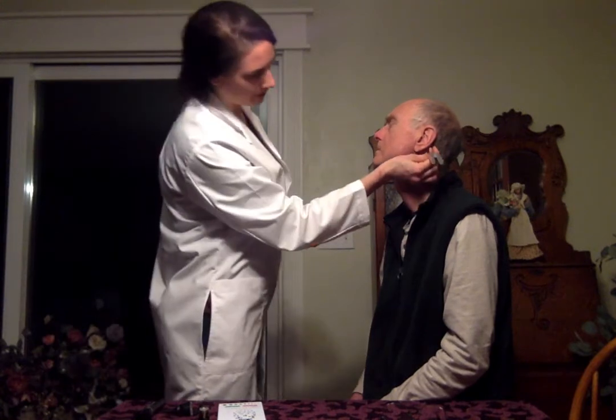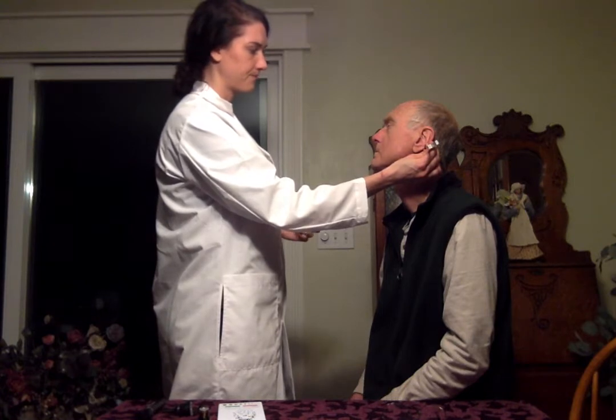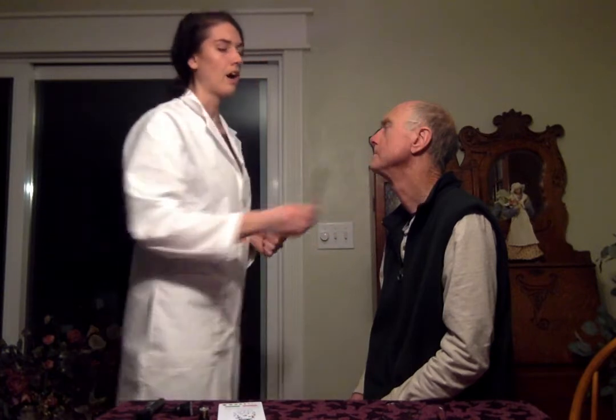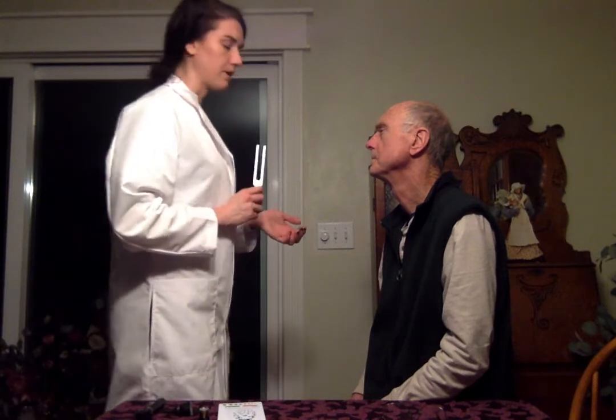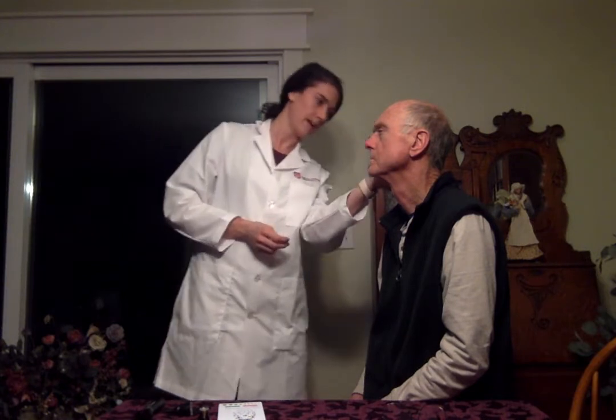I'm going to go ahead and do the Rinne test. And this is where I'm going to place this on the mastoid behind the ear. And then this is measuring the air conduction versus the bone conduction. So I'm going to go ahead and place it on the mastoid. Tell me when you cannot hear it anymore. Okay. Can you hear that? All right, that means that the air conduction is greater than the bone conduction, which is good and within normal limits. So I'm going to go ahead and do it on this side. Go ahead and tell me when you can't hear it.